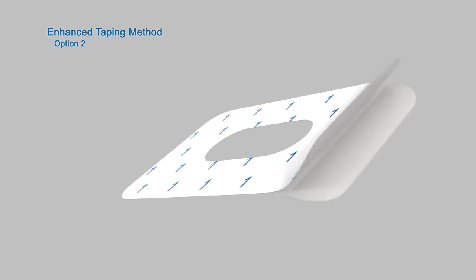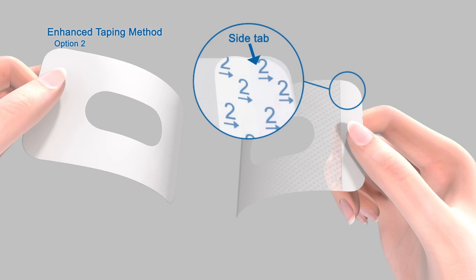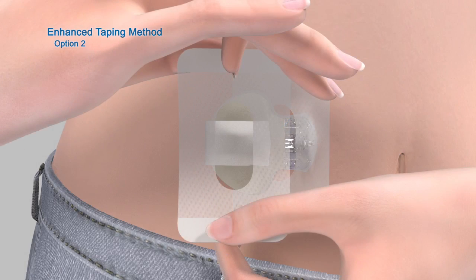Now let's see how to apply the tape in Option 2. First, remove the paper backing marked by the number 1. Do not remove the two smaller tabs on the sides of the overtape just yet. Next, hold the overtape by the covered ends and position it so it is oriented the same way as the first piece of tape.